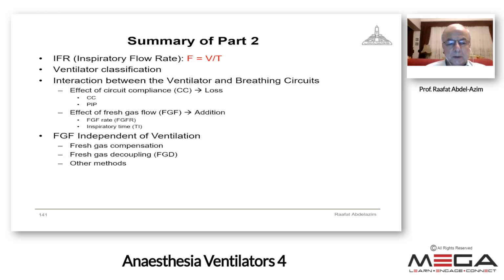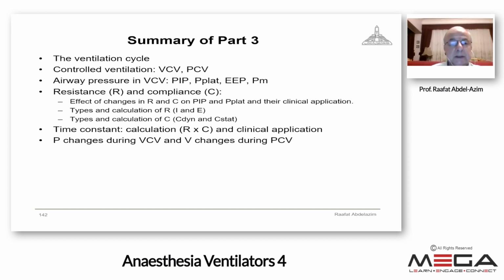And I talked about fresh gas flow independent of ventilation, to abolish the effect of fresh gas flow added to the tidal volume by fresh gas compensation or fresh gas decoupling. And I discussed it in detail.